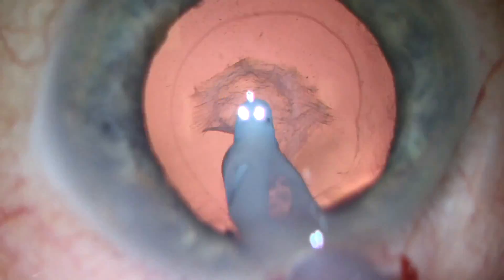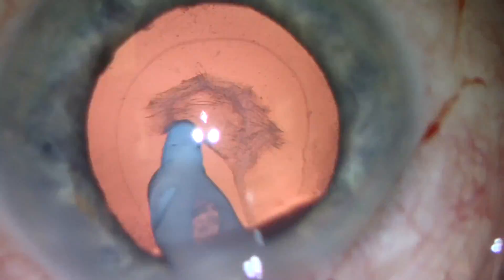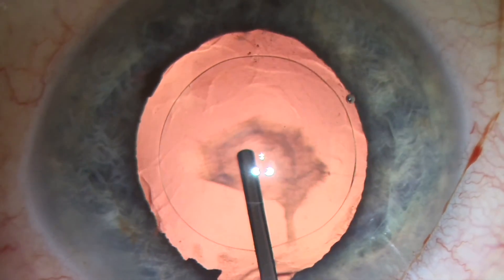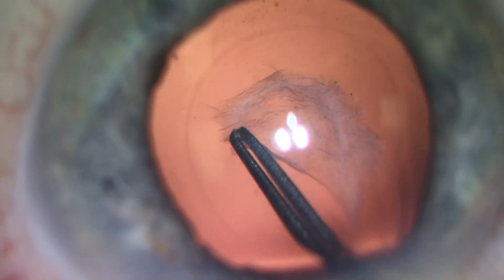We stabilize the capsular bag with Helon GV and attempt to peel this tenacious plaque from the capsule, knowing that we have as a backup plan the ability to control any posterior capsular opening and rescue it by performing a posterior capsulorexis.